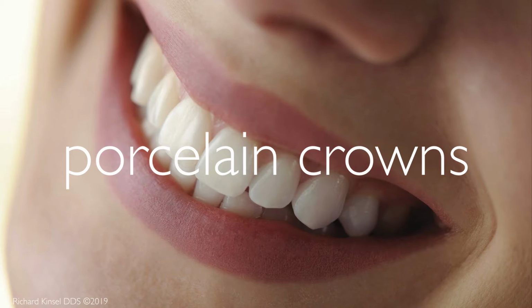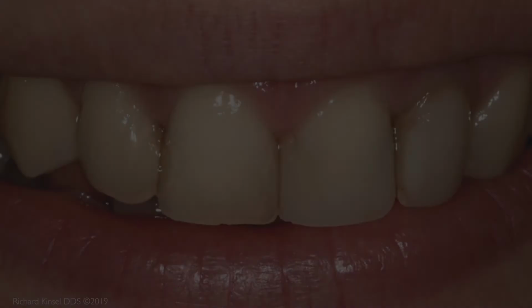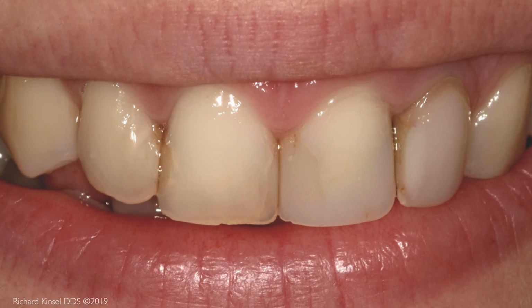Porcelain crowns are usually needed for patients with compromised tooth structure, large restorations, and old crowns requiring replacement. In this example, the patient has 4 incisors with large defective composite fillings.